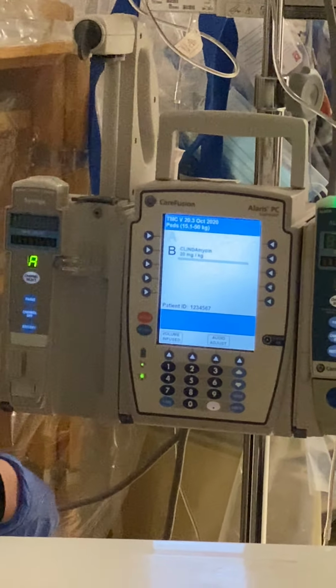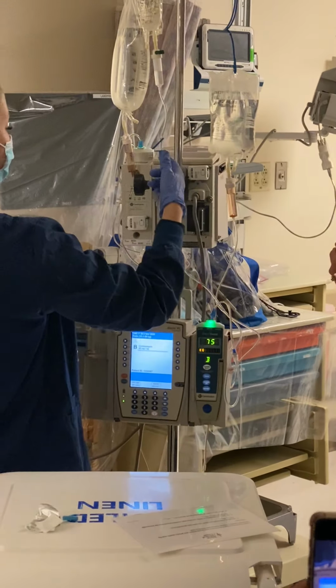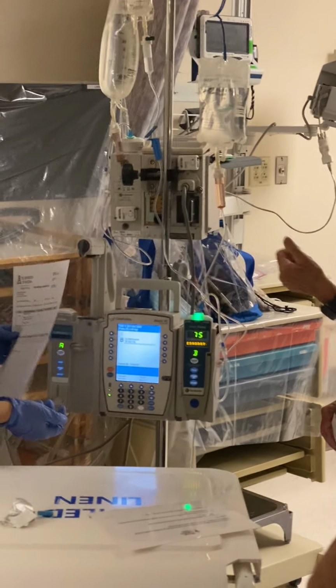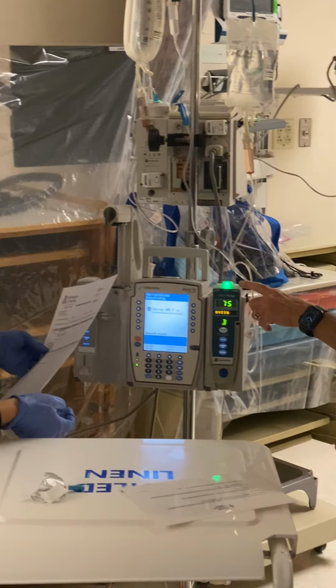And you need to unclamp your clamp. You've got both your clamps clamped. I'd recommend just clamping one. The roller clamp is usually what I clamp. Then you can easily unclamp, and you have to check to make sure the green light is on.